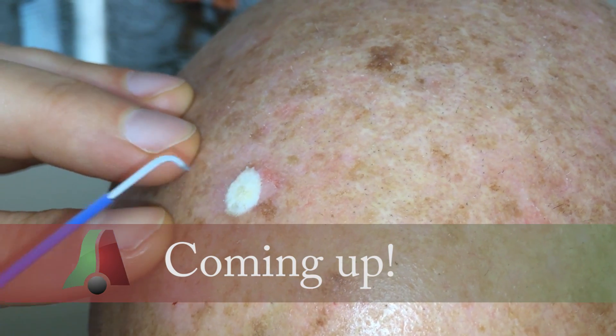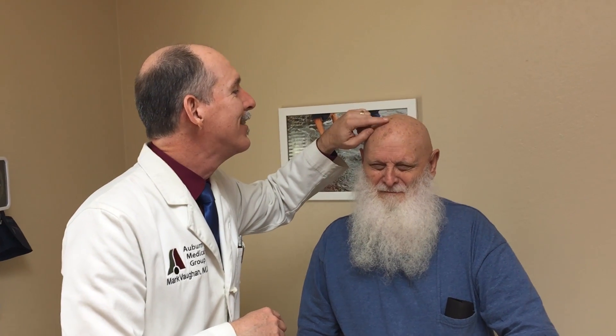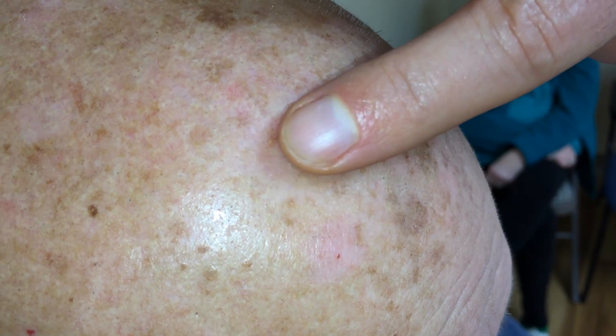Thanks for joining us. Ron comes in needing two things done. We need to do something with your ears, and I also need to freeze this actinic keratosis off of your forehead.